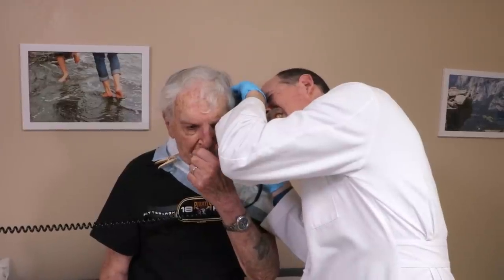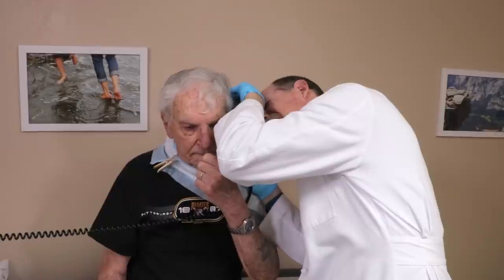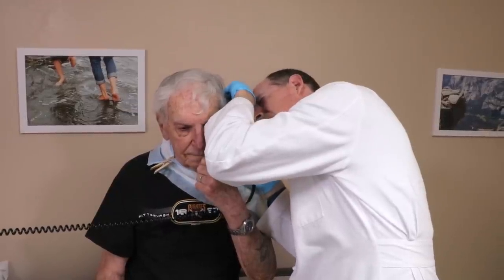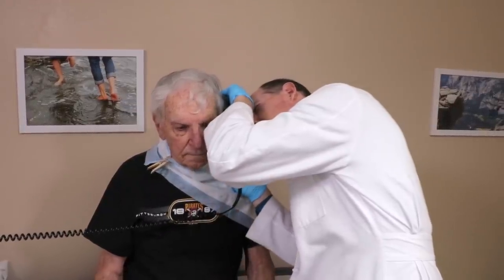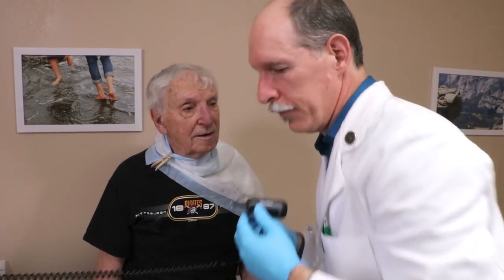Okay, stop — nothing happened here, there's nothing to see here. It's just a really irritated eardrum from all that irrigation. The wax is finally out. Is it really? Yes — that's what all that was. Wow.